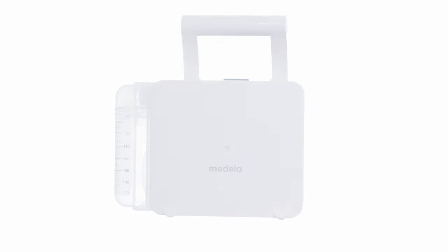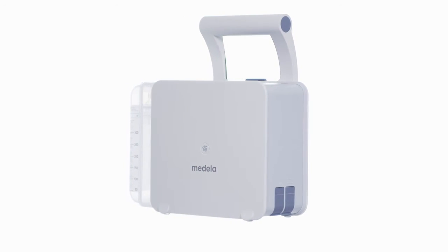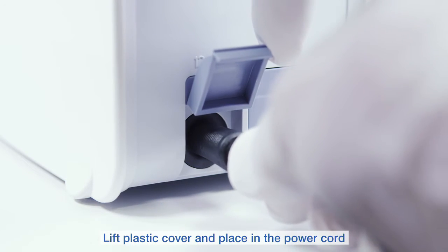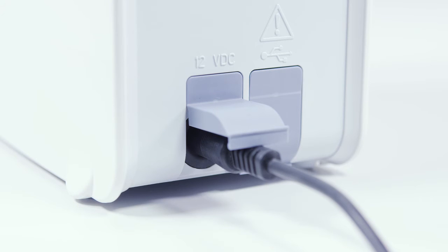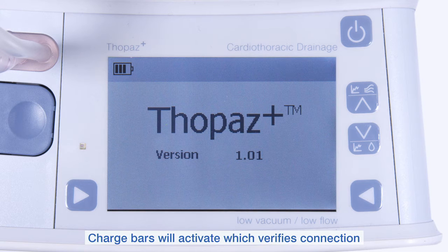Charging Topaz Plus. There are two methods of charging Topaz Plus. The power cord can be plugged directly into Topaz Plus by lifting the plastic cover. The charge bars verify that the power cord has been attached correctly.